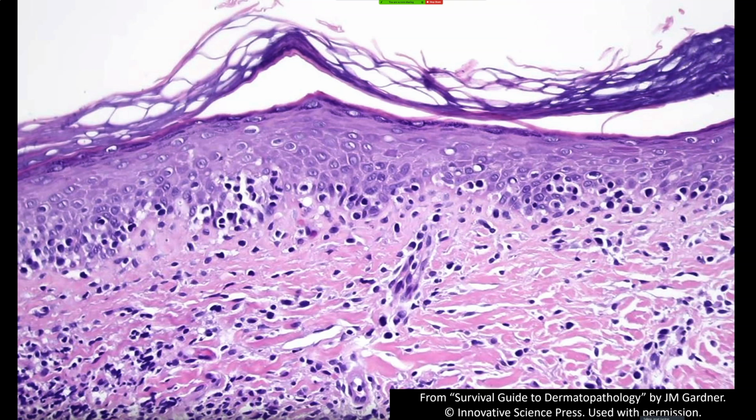And that takes several forms. One of the forms is this, what we can call tagging. The atypical lymphocytes, they're hyperchromatic and a little bit enlarged here, but they don't always look that way.